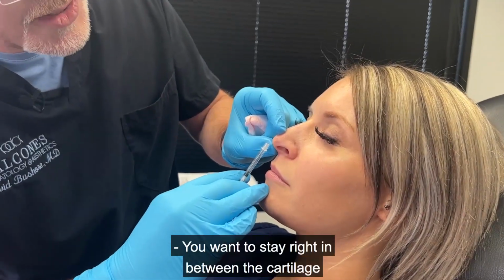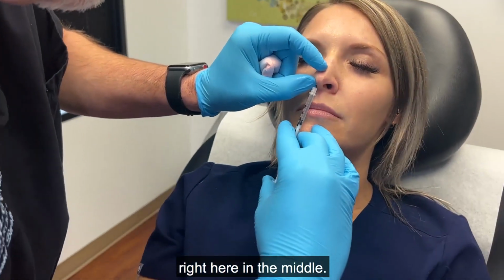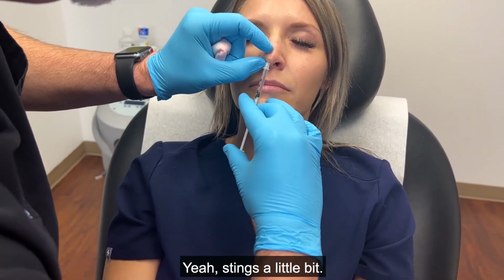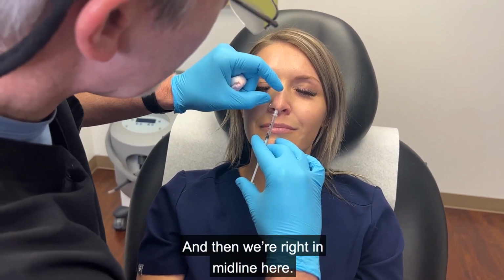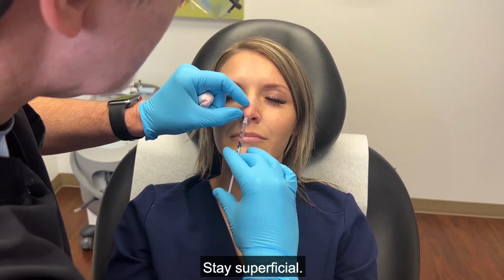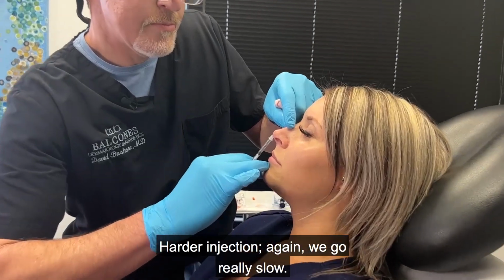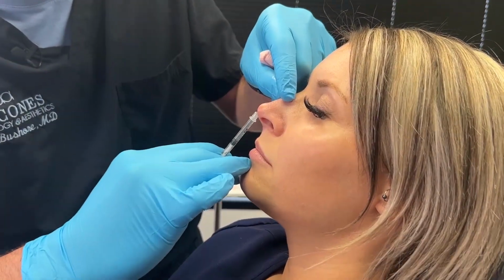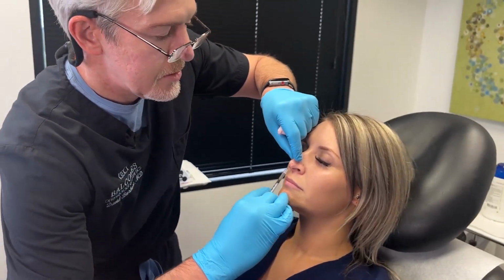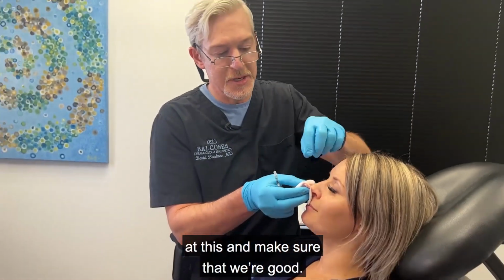So we want to stay right in between the cartilage right here in the middle. And we come down here and then we'll inject here. Yeah, it stings a little bit. And then we're right in midline here. Stay superficial. Start our injection. Again, we go really slow. Good. Got about 0.1 in so far, and then we'll just take a look at this and make sure that we're good.